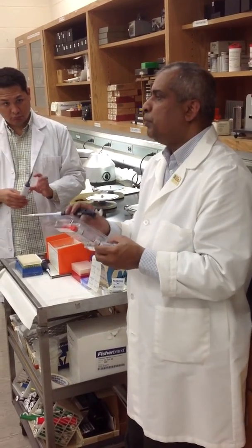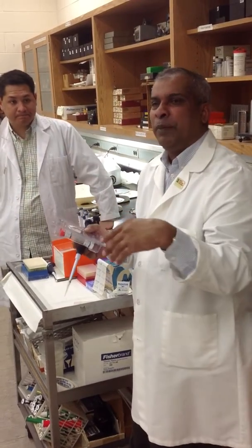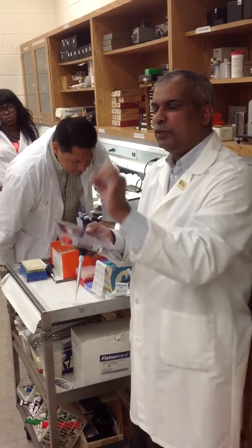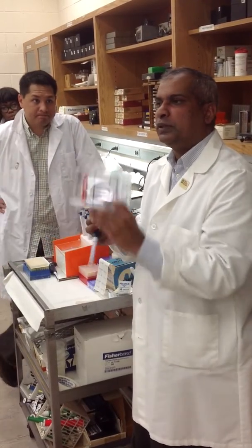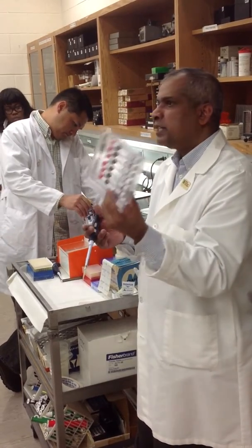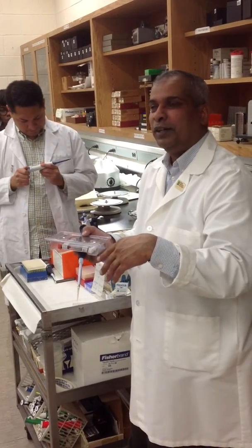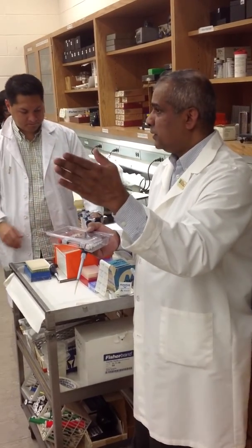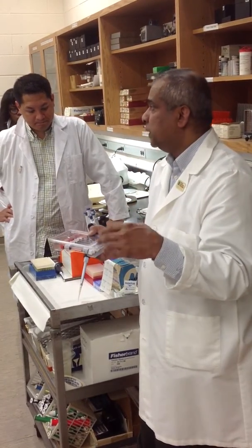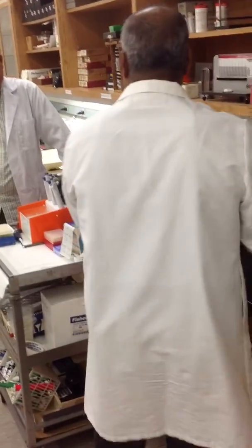Because the companies, they send you a disk, it goes into the machine, and it puts all the parameters in there. So now when you run it, you tell the machine which samples you're using, whether you're using normal, low, or high, and when you run the test, it matches it to the parameters given, and it will tell you whether it's good or if it's out of range and things like that. And so we buy this. So this is extremely accurate.